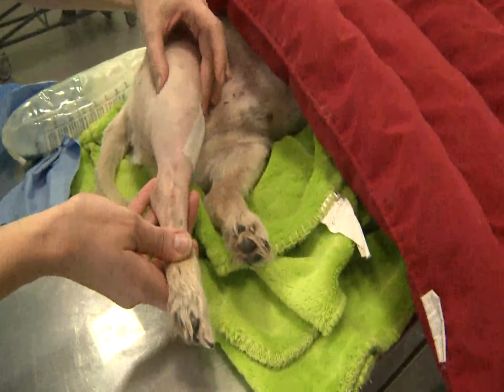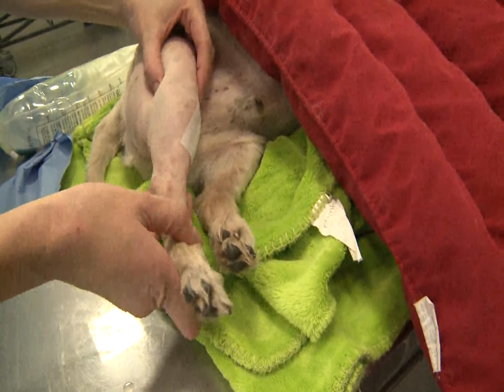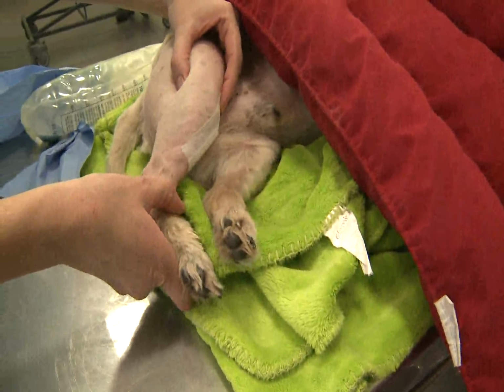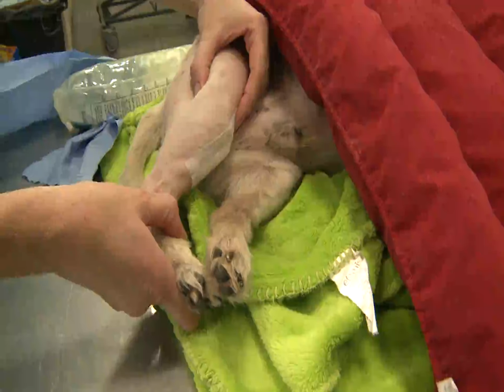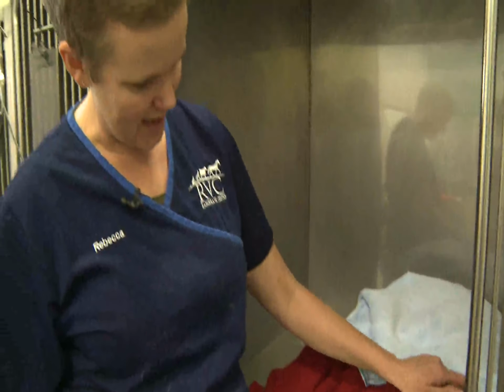This is that bony bump that we were looking at before, and when we put some weight bearing through his knee before, it moved forward. Now with the angle changes that we've made, it doesn't move forward when we put weight bearing force onto his knee. So he's aware of what's going on with him now.